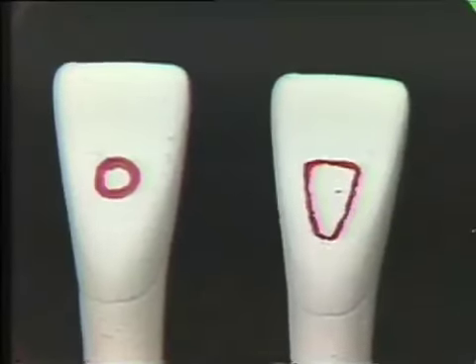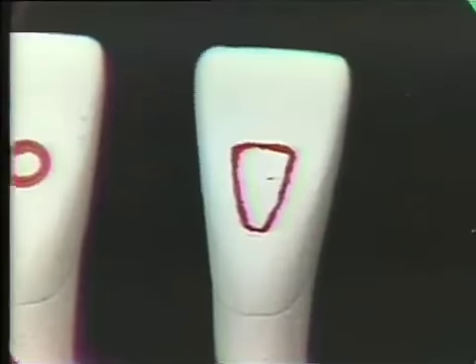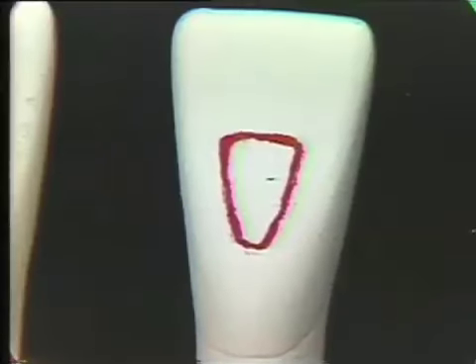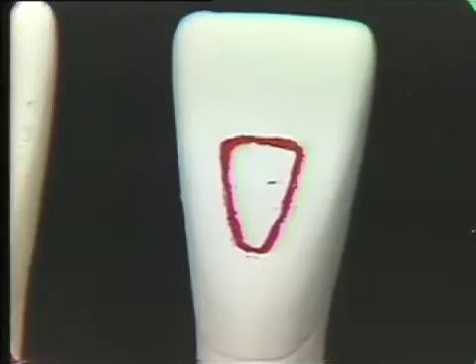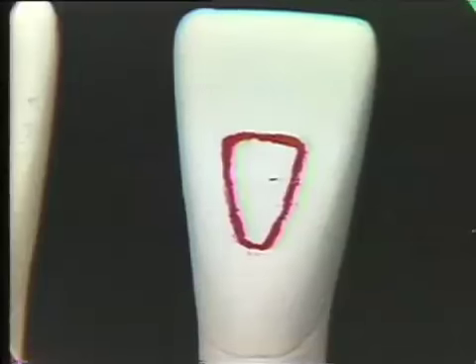I hope you chose the one on the right. You notice from the radiograph that the pulp was very narrow, but the crown shape tells you that it's a triangular crown shape, much as the maxillary central incisor was, only the tooth is very long in a labiolingual direction. So the outline form of the pulp will be somewhat triangular, very narrow mesiodistally, and very long labiolingually.